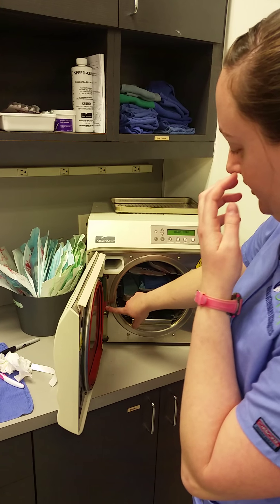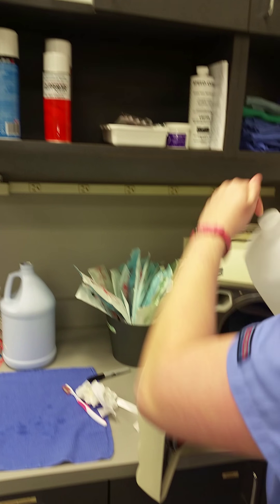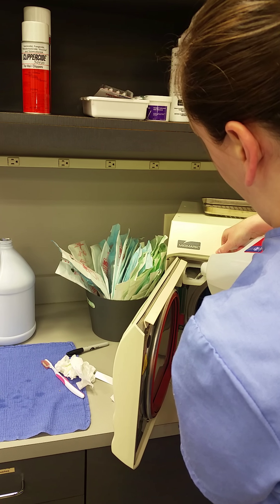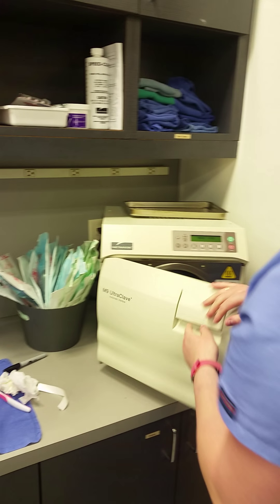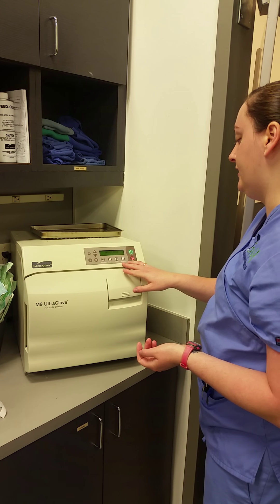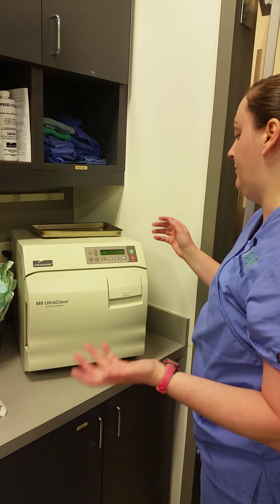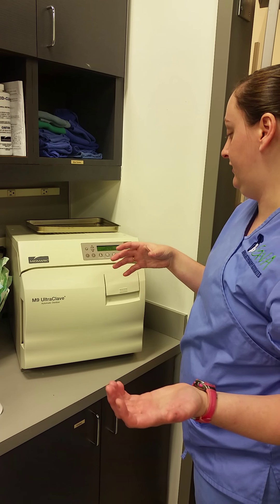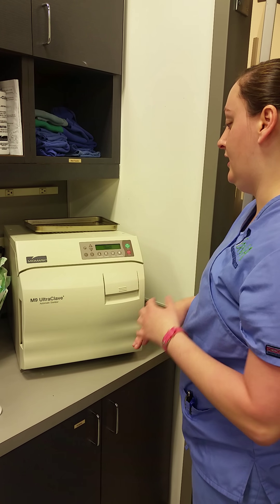You want to make sure that you have enough water in here — it needs to be in the green section, and you can only use distilled water. Once it's in the green, then you're good. Close and lock the autoclave. You've got your options: unwrapped, pouches, packs, handpieces. So you select pouches. It'll tell you how long it'll take for the steam to get warm enough and how long for sterilization. After you hit pouches, all you do is hit start and it'll do its thing.